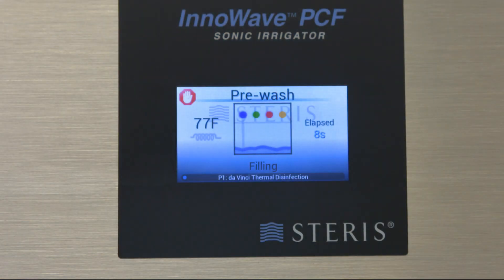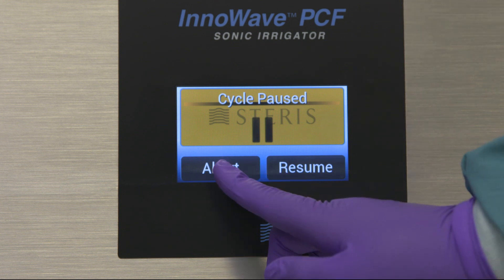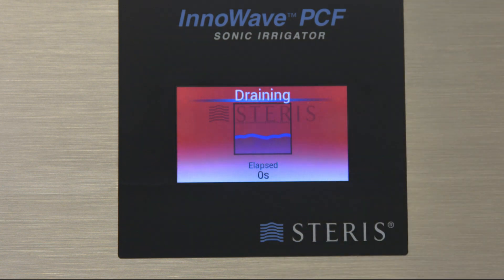Occasionally, you may need to stop a cycle before it is complete. Press the cycle pause button to pause the cycle — you will now see the cycle paused screen. Select abort to cancel the cycle. If the abort sequence is confirmed, the unit will automatically drain.